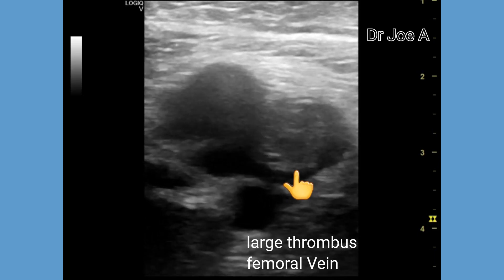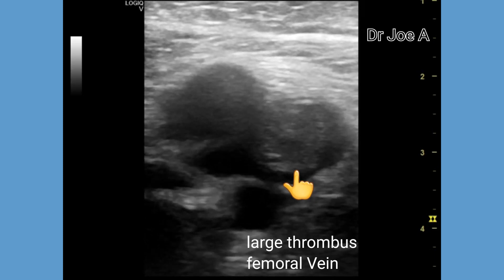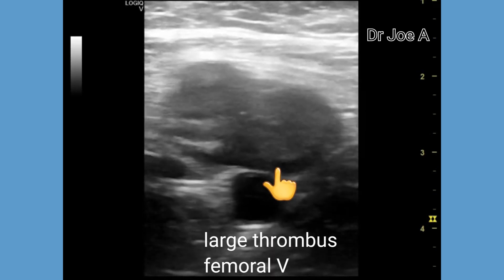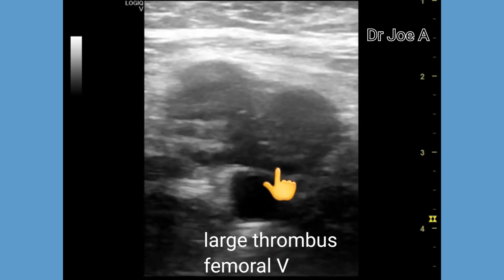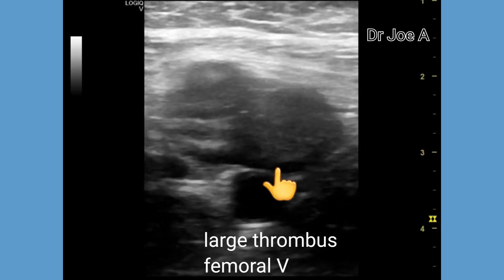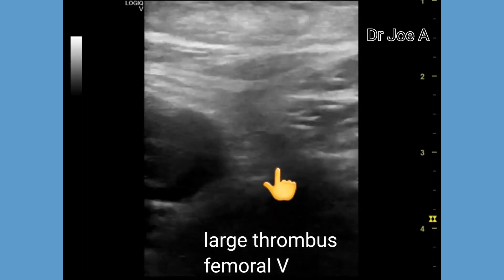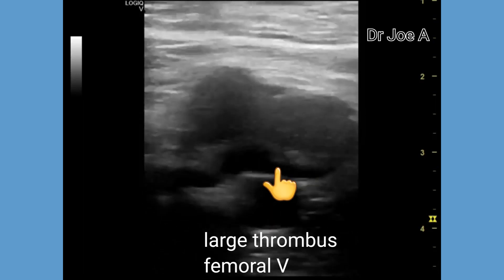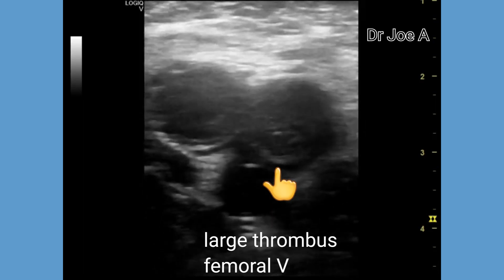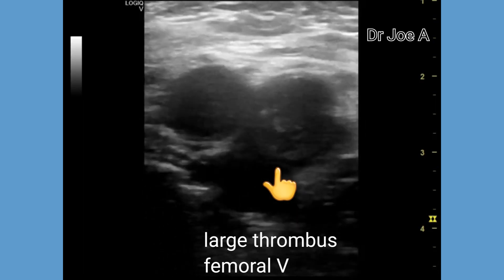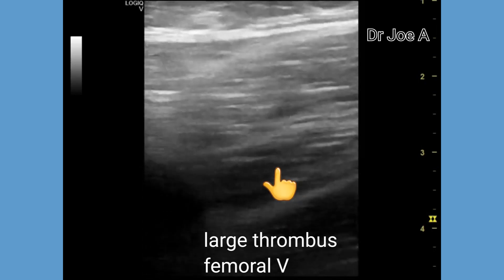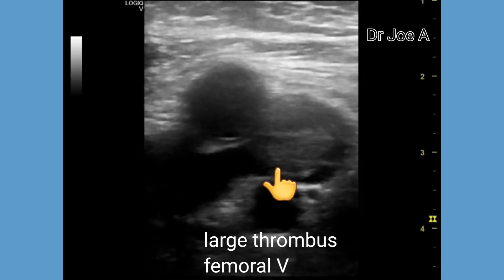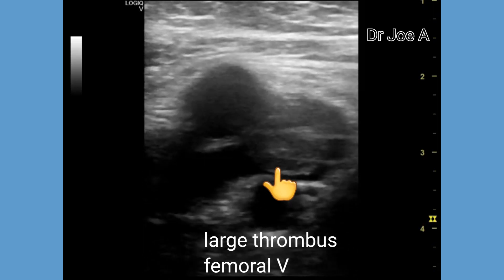The vast majority of lower extremity deep vein thrombosis develops in the veins of the calf, namely the peroneal veins, posterior tibial veins, and the veins of the gastrocnemius and soleus muscles. On ultrasound, this thrombus is seen as a non-compressible venous segment — meaning the femoral vein in this area is non-compressible.